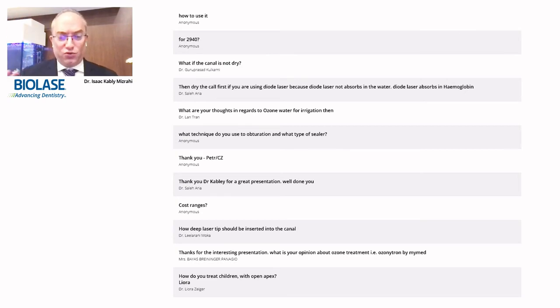But to answer your question concretely, just go deep to the working length with a radial firing tip in order to get that negative pressure and create that mechanical bubbling and cavitation effects from the apex to the coronal opening of your access.